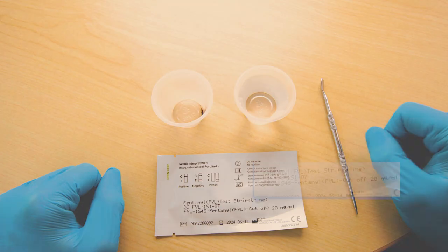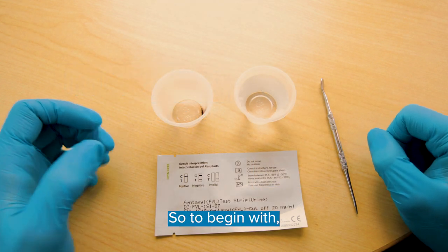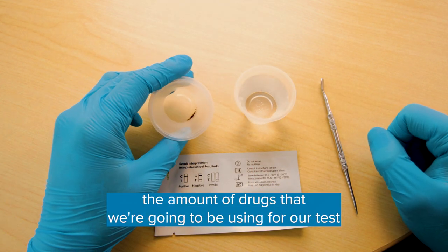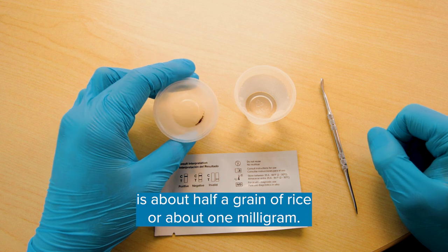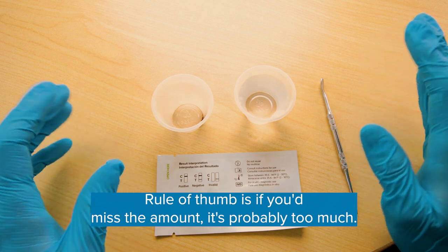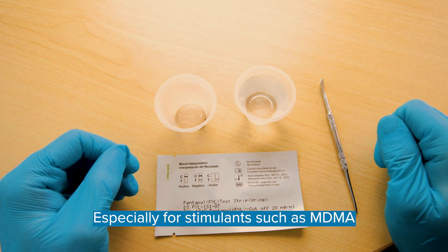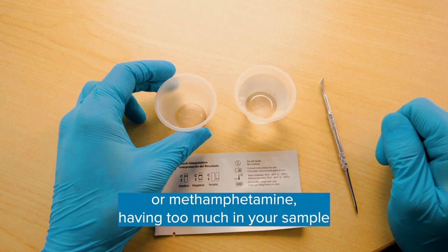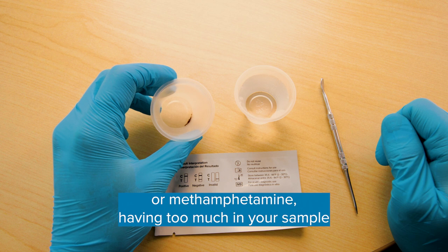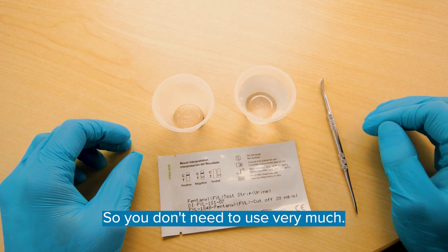Let's begin. The amount of drugs we're going to be using for our test is about half a grain of rice, or about one milligram. The rule of thumb is if you'd miss the amount, it's probably too much. Especially for stimulants such as MDMA or methamphetamine, having too much in your sample can cause false positives with the test strips. They're very, very sensitive, so you don't need to use very much.